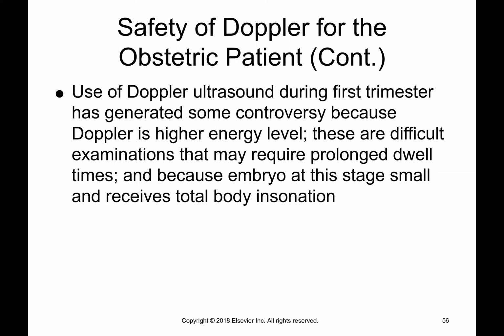Now, I have to say something. I do not teach that we do pulse wave Doppler ultrasound during the first trimester. So let's say a patient comes in, and the baby is 5 weeks, 4 days. That little heart has just started beating, just started.